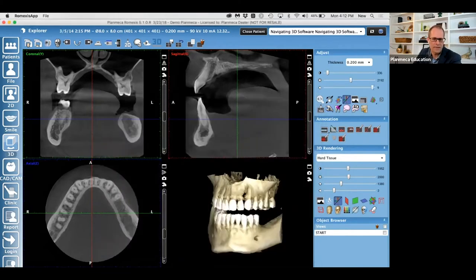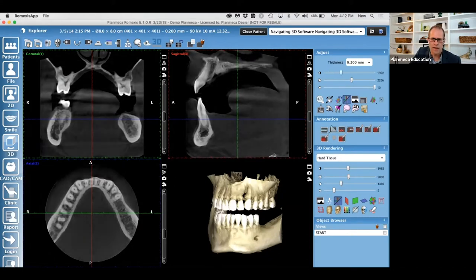But please understand that when you're using any 3D software, each patient is going to be affected differently by the amount of radiation. So you may have to adjust your contrast and brightness depending on your monitor. So if I could give you one tip and trick or a couple tips and tricks on contrast, brightness, and sharpen, I would probably suggest that typically you see images more on the high contrast side. They usually come in a little bit blurrier. So typically this is what a 3D image would look like natively taken from a 3D machine.